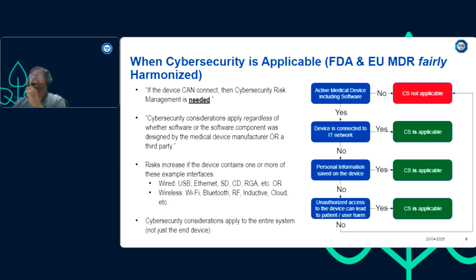Now, there are a lot of questions and always debate going on about third party software or off the shelf components. If you read all these standards, it's not only FDA, EU, or for that matter, any other standard. It's predominantly mentioned that whatever is going to be packed within your device as a product, you need to take ownership of all of it. So if you are getting your software developed from a third party vendor, you need to make sure you have tested it thoroughly at your end to make sure your product is safe and secure. Similarly with off the shelf components, where you are using simple libraries like jQuery or, for that matter, any third party library which is available on the internet, all those should be considered in your risk management file.